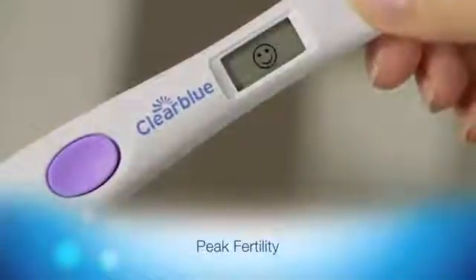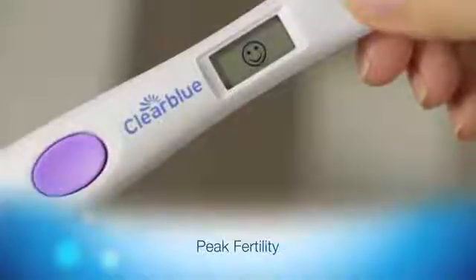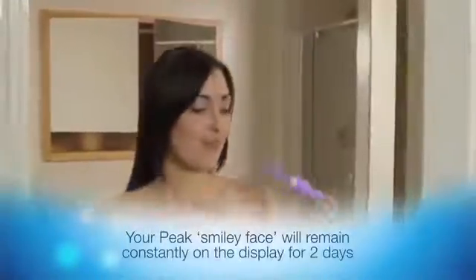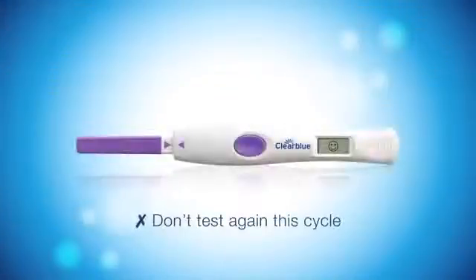When peak fertility is shown, indicated by a solid smiley face, ovulation should occur within the next 24 to 36 hours. Your peak smiley face will remain constantly on the display for two days, as this is when you are at your most fertile, and having sex will maximize your chances of getting pregnant. Don't test again this cycle — the holder will not read another test stick while the smiley face is on the display.